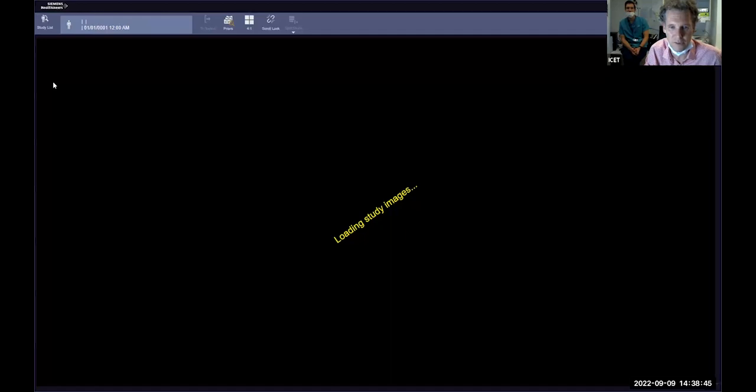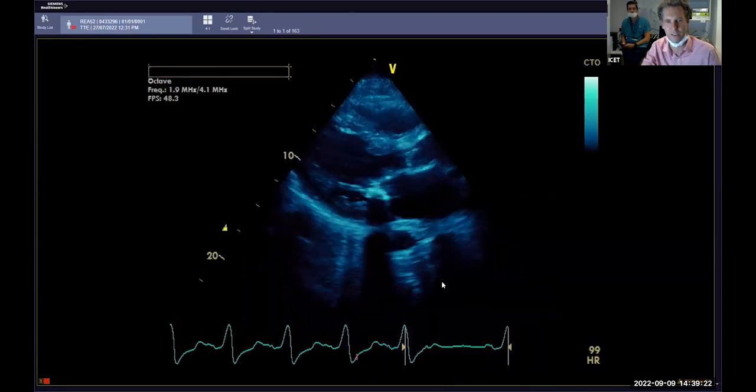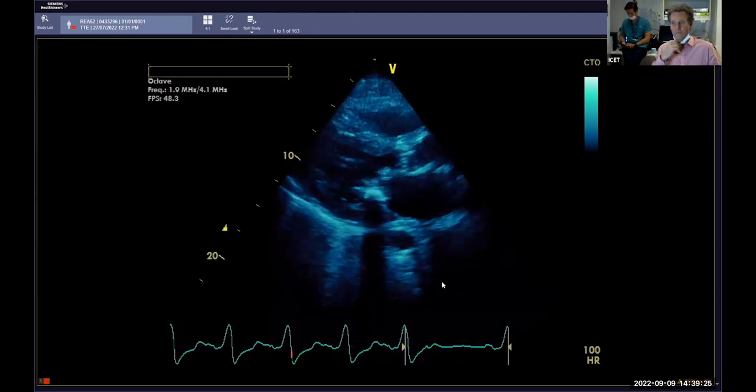Load up. Maybe let's do a. Okay. All right, I'm just going to load up the images and then just blank out a bit of the screen. It's got the patient's name on, and then I'll get this patient back up again for you. This is one of his patients. Ben, are we able to steal you again?